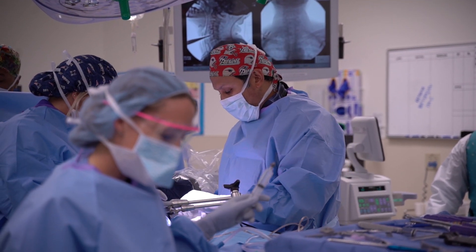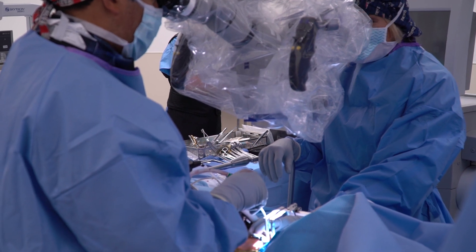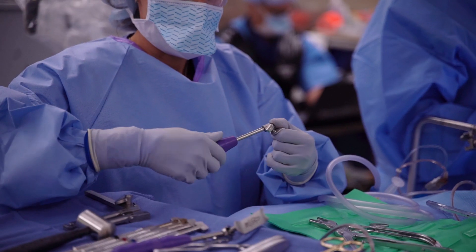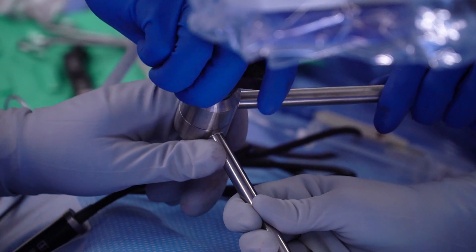We're always looking to improve our surgical workflow and the surgical experience every time we set foot in an OR. The more time you spend in the OR and the busier you get, you want a system that reliably works for you — one with interchangeable parts, arms that hold, a locking mechanism that maintains, and that the staff knows how to use again and again. Spending the time to make sure the access is done correctly is one of the biggest things. For this reason I like the Phantom — it reproducibly does the same thing every time in a reliable manner that actually allows it to improve your exposure.